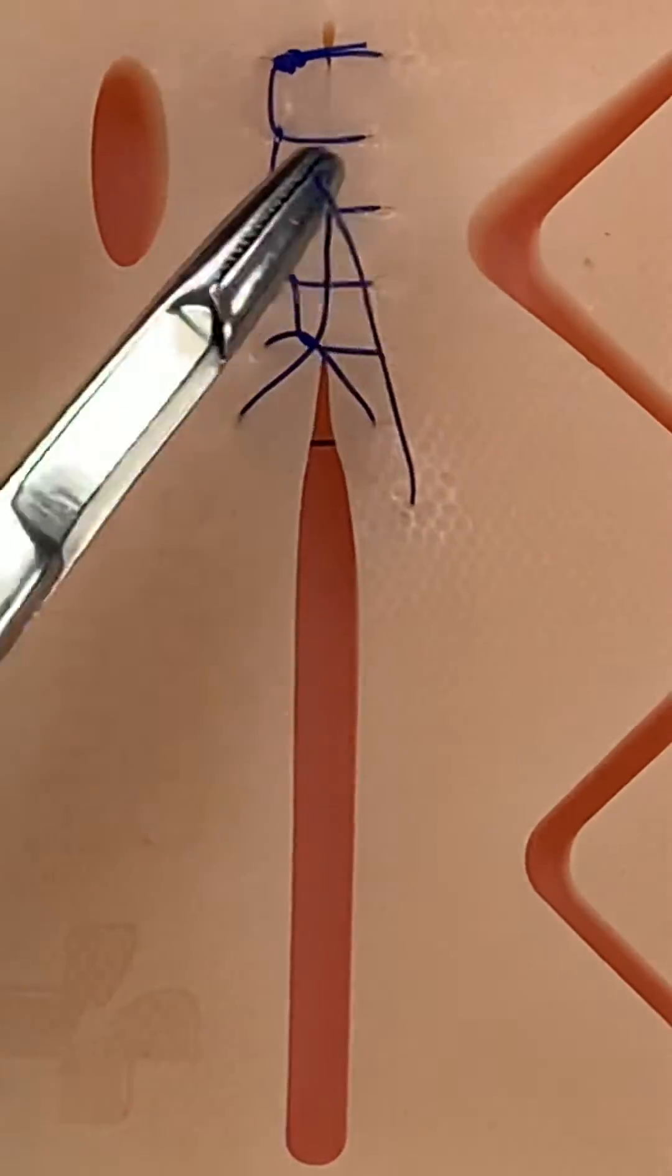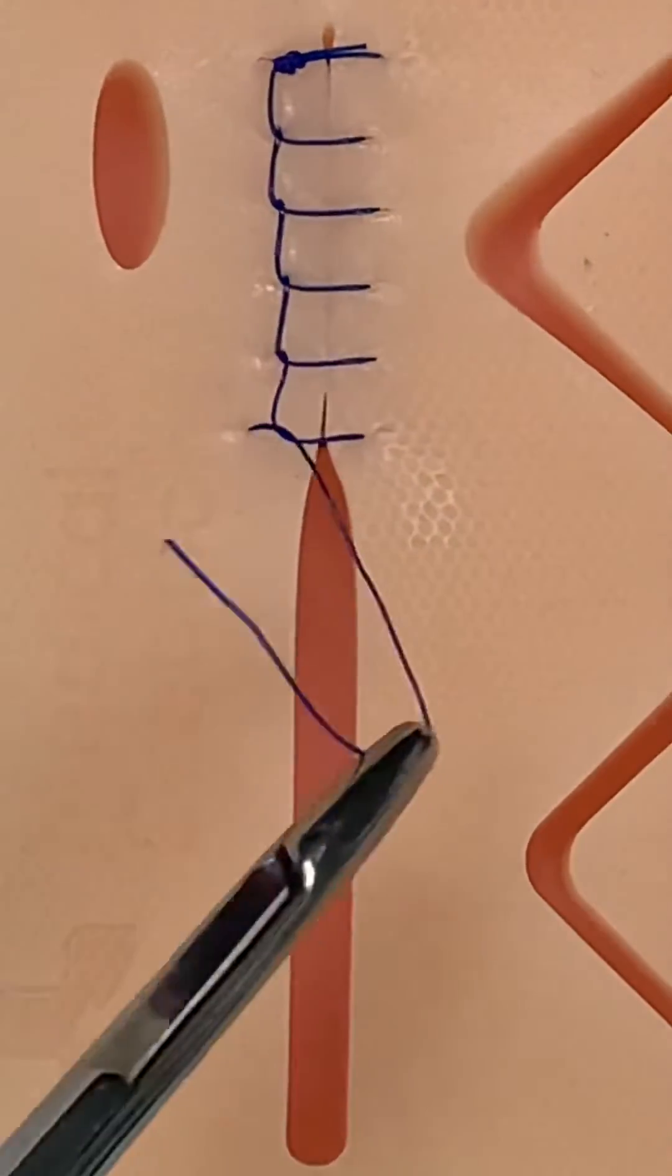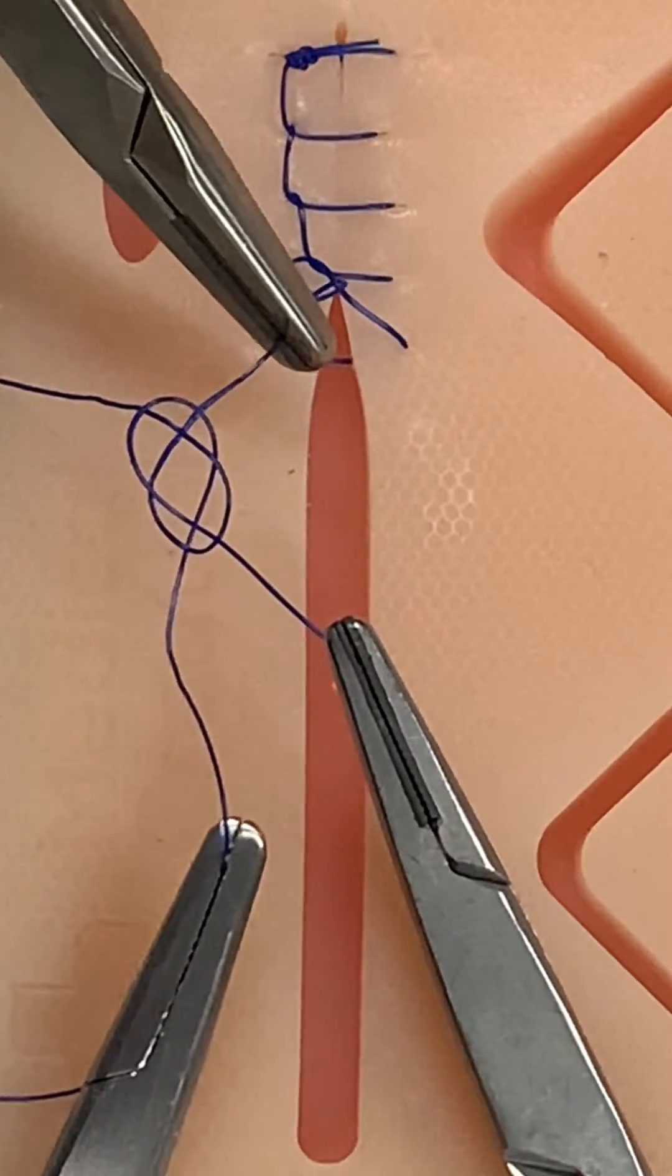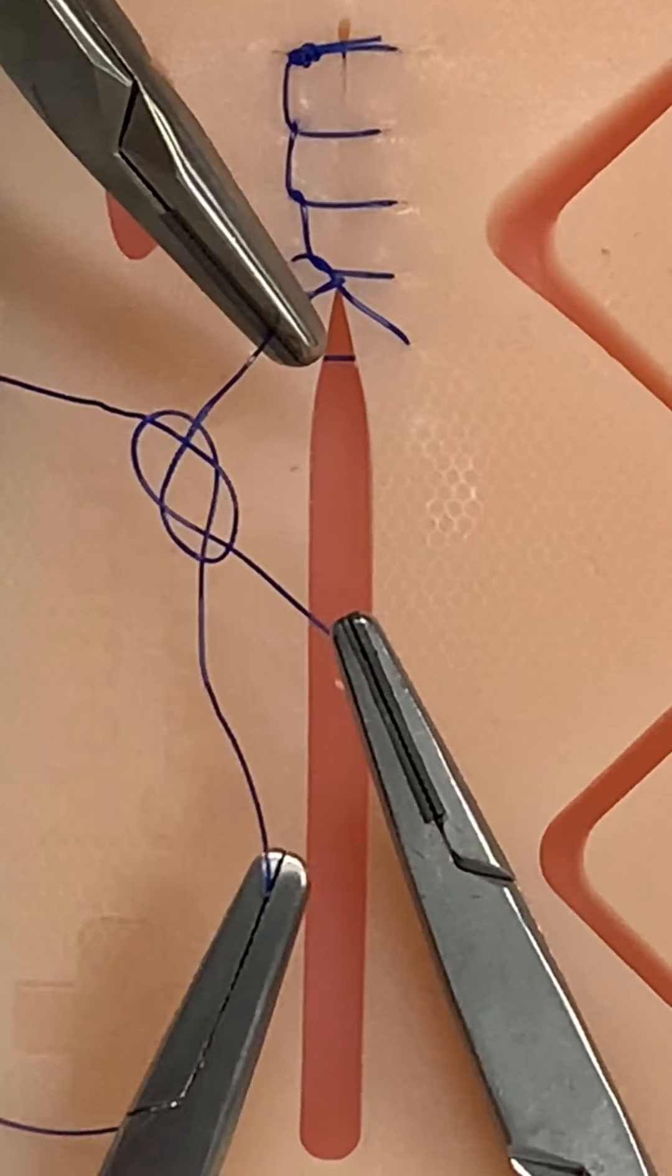But instead of completely unraveling the suture and starting all over again, you can use a bend technique. Bends are knots used to reattach two ends of suture material. The carrick bend, or sailor's knot, is one that's used in eye surgery.